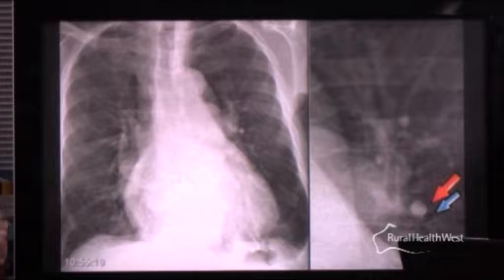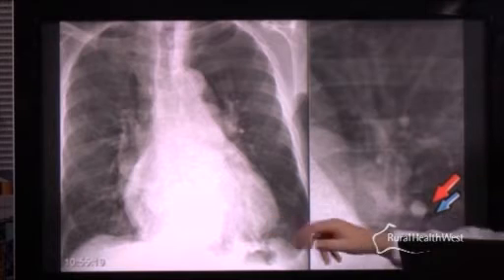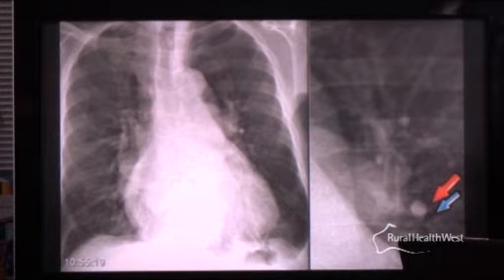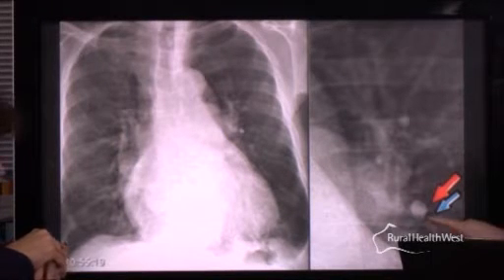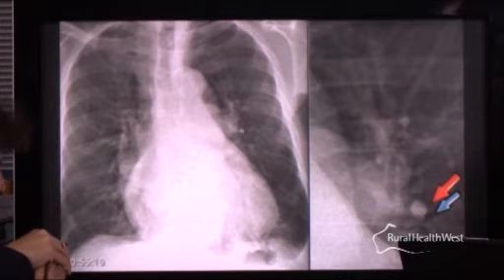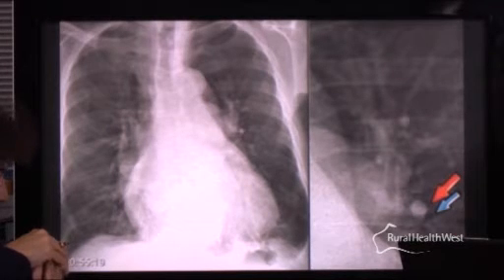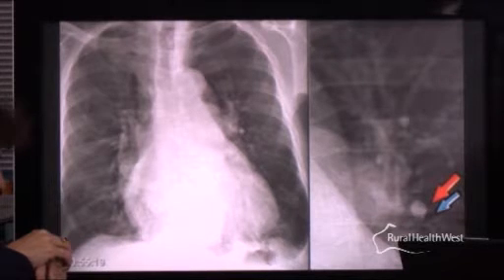Sure. So this is just a series of X-rays looking at patients in congestive cardiac failure. The first thing on the PA film, making sure that it is a PA film and not AP, look at the heart size and see if there's enlargement. Is it greater than 50% of the normal cardiothoracic ratio? And when you look at the vessels, this is the early stages of congestive cardiac failure. You can see there's a vessel accompanying a bronchus, and in this case the vessel is larger than the bronchus, which would suggest that there is a dilatation of the pulmonary veins.